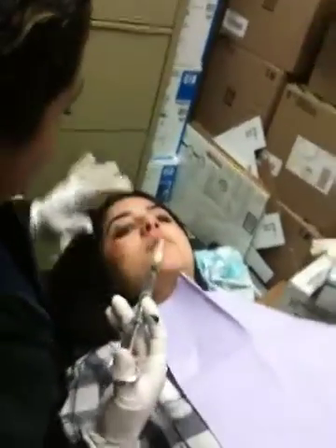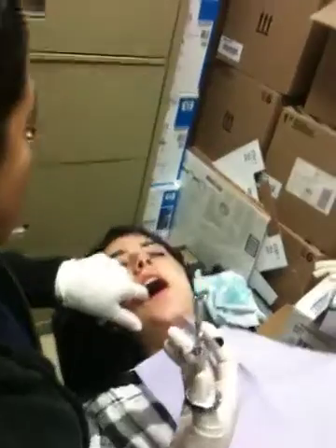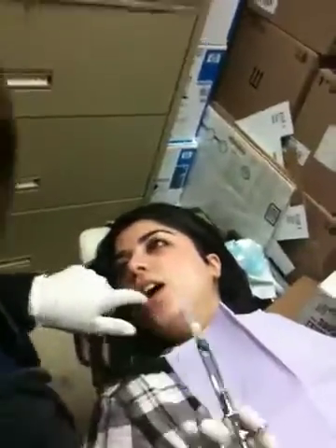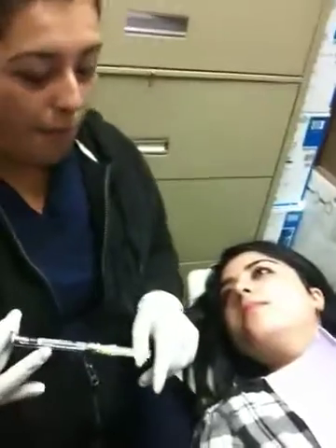What if it's the lower right? Where are you going to give the lower right? How are you going to give the lower right? Turn a little bit towards me. Can I go like this? Why would you want to do that? If you're going to give a buccal block, that's the only time you'd go in that way.